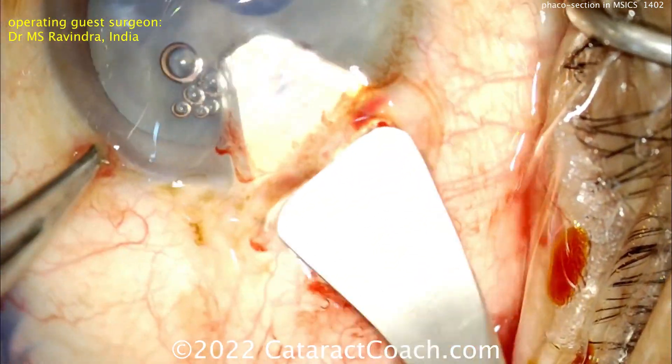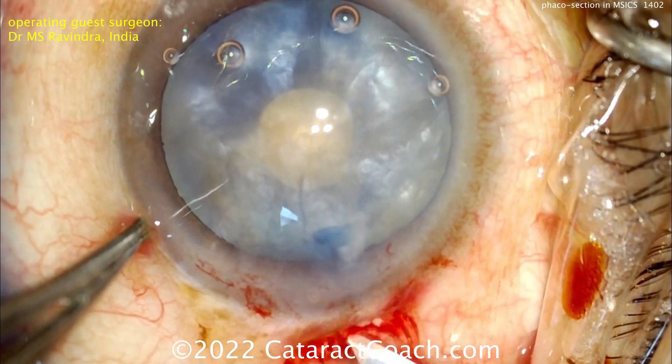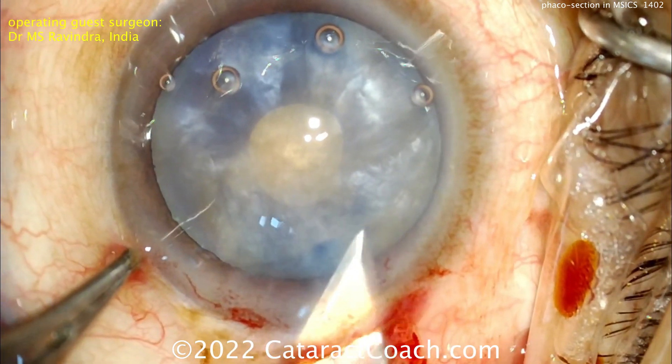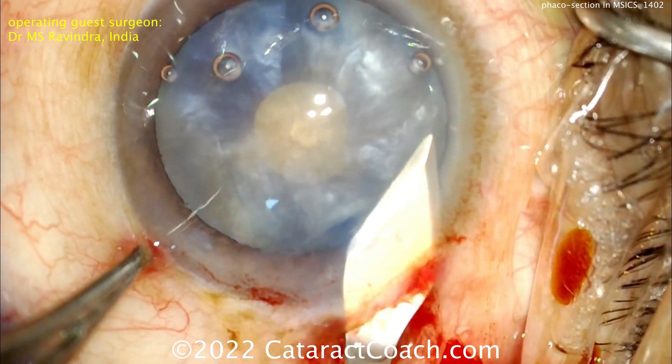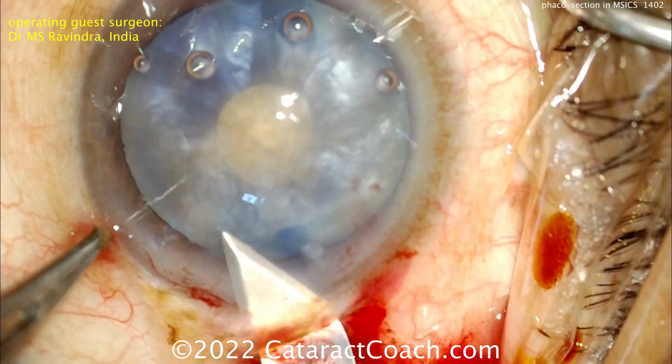Now the incision is opened up with a wider blade, probably about a 4mm blade, and now a little bit more tunneling — making a funnel-shaped, trapezoidal-shaped incision. Now it's looking a lot more like an MSICS incision. That looks great.